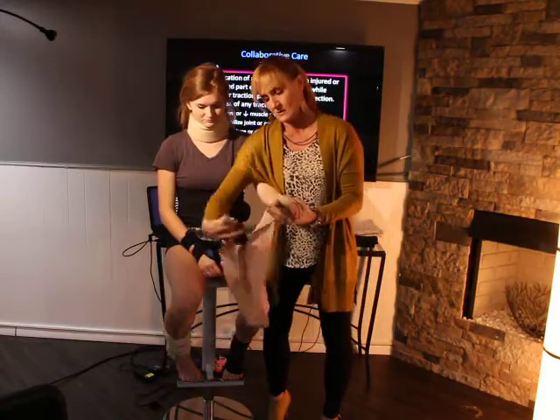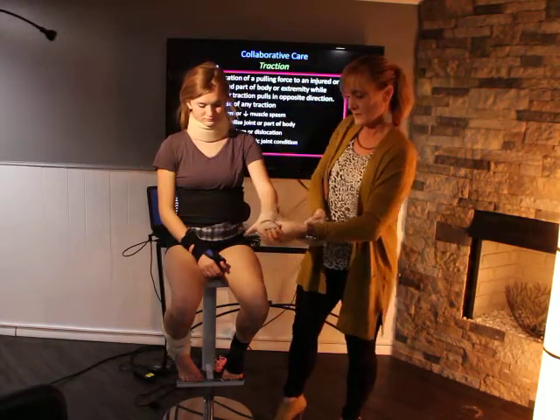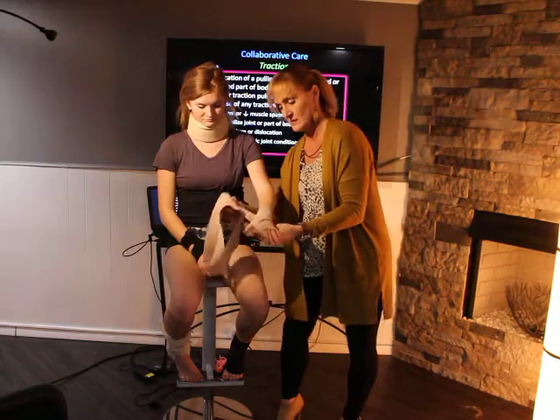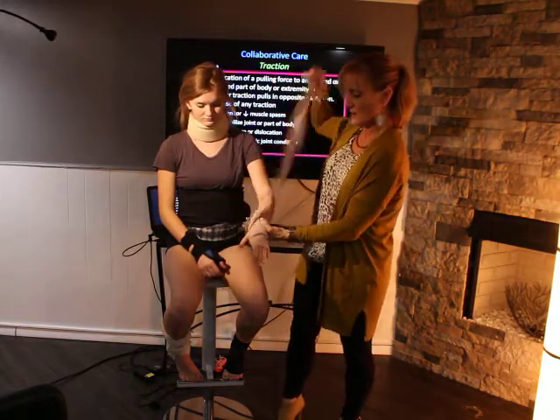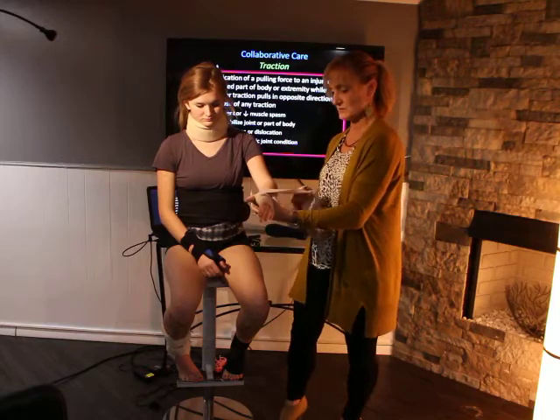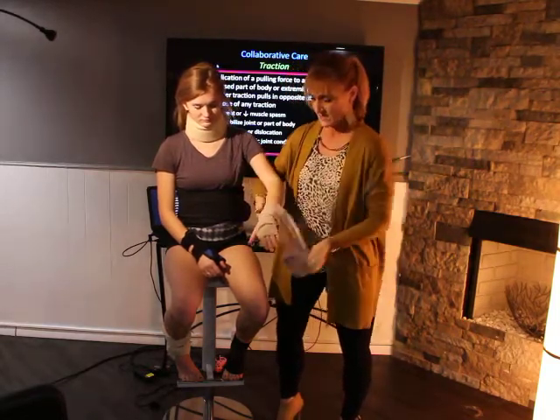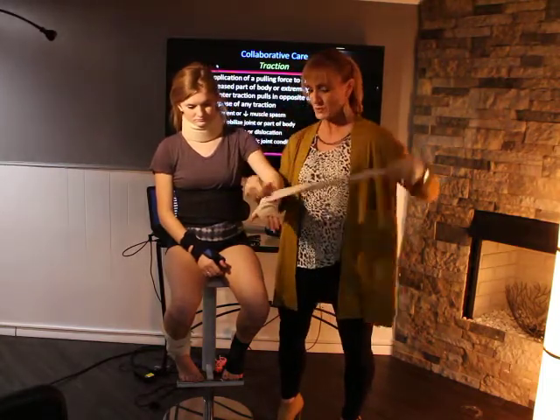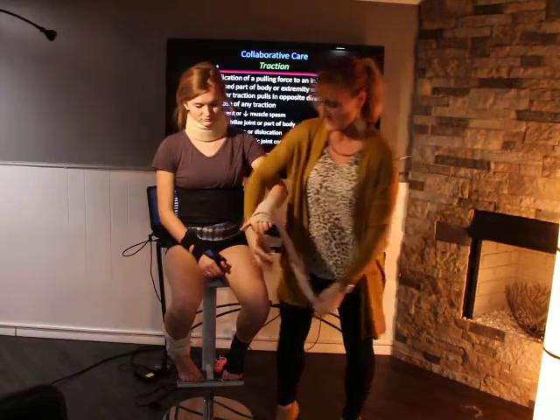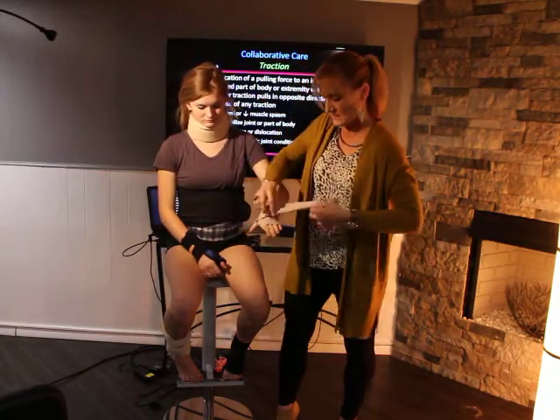Okay, you're gonna wrap it up around the thumb. You're gonna go around this joint. You're gonna come up a couple more times around this joint. This ACE wrap that I'm using is too big for the area. And then you can go back down. And what you're doing is just offering a little bit of support, but you're going to remember you want to start from the bottom and go up. But it's okay to go back down because you can have a couple of layers on here.